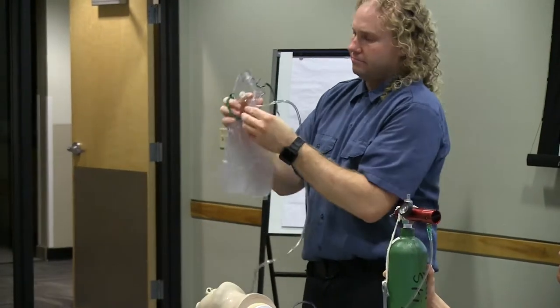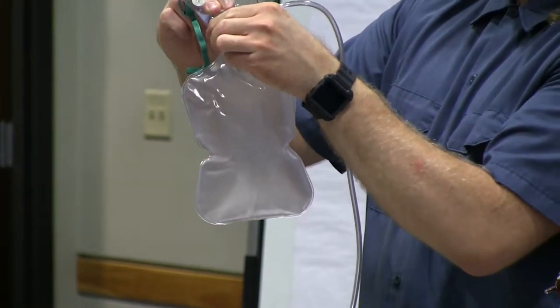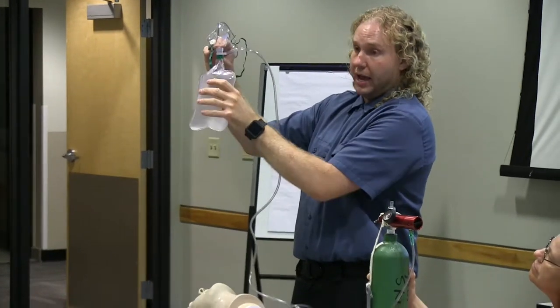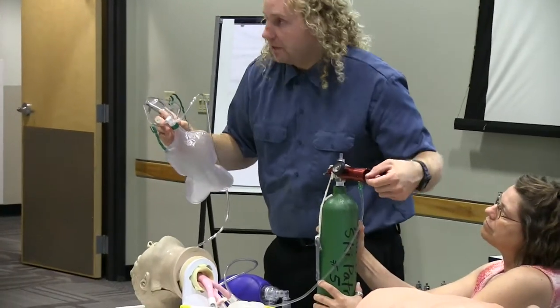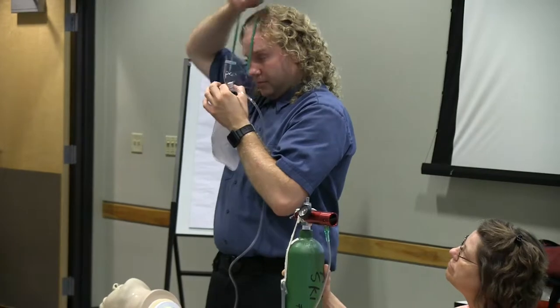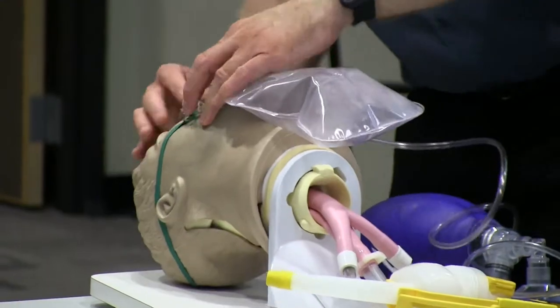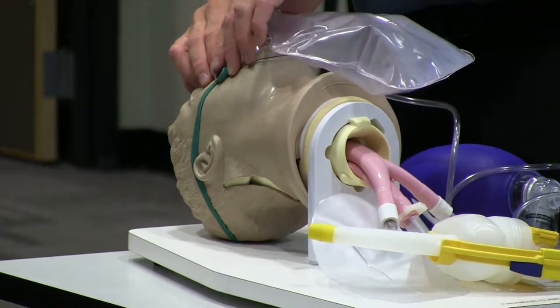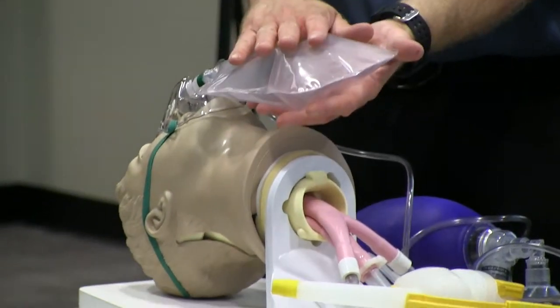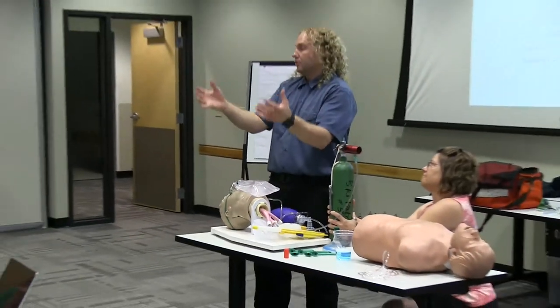With a non-rebreather mask, I need to fill the reservoir bag. I do that by occluding the little valve inside to fill the bag. The way I judge whether I have enough flow is whether the bag deflates completely as the patient breathes — that bag should remain inflated. If it's deflating, I'm only at 10 liters per minute and I need to turn it up to 15, because I'm trying to deliver 100% O2. To put it on, I like to put it on the nose first, wrap it around the head, and press the metal piece into place to get a good seal so they're only breathing in from the bag and the oxygen tank.